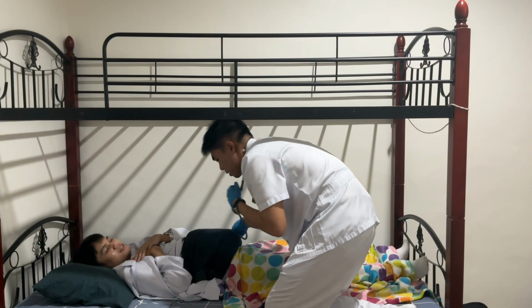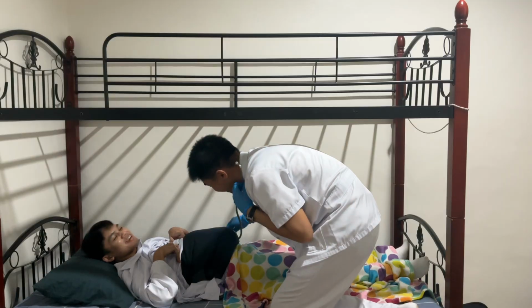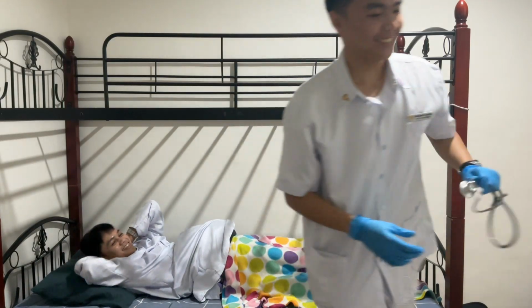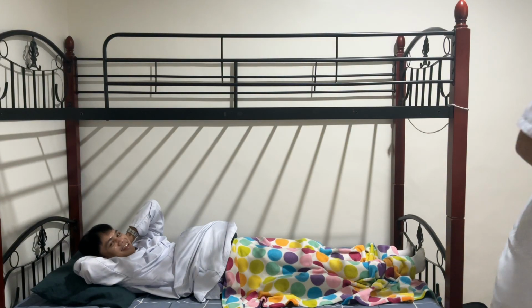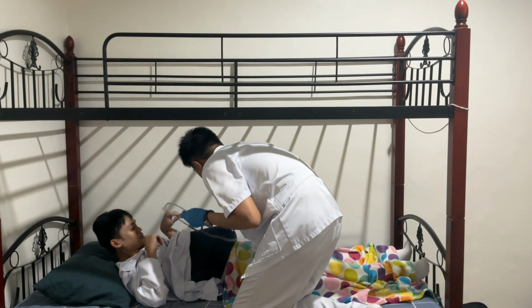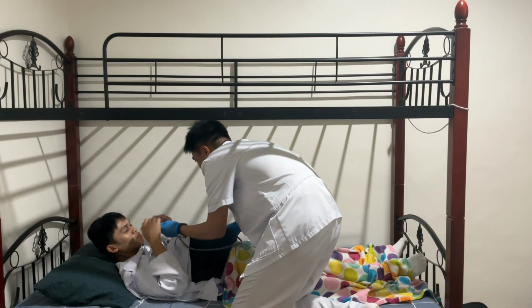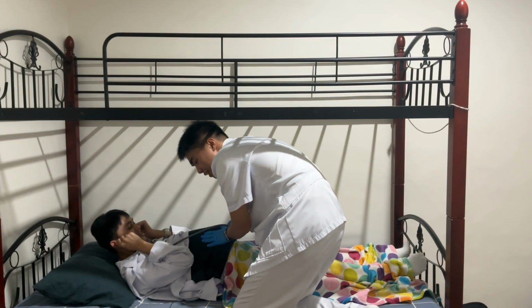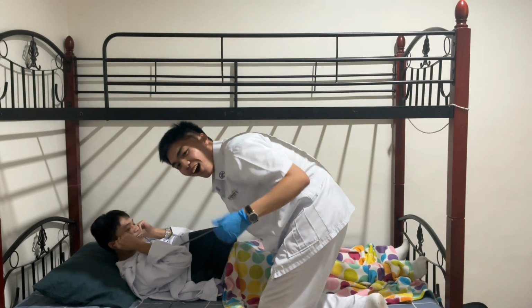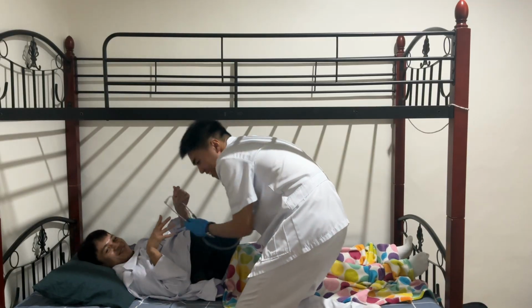So assuming it was 1 minute and I have listened to it, ma'am, do you want to listen to it? I will clean the stethoscope now so that you can listen to it. Here it is, ma'am. Where was it earlier, ma'am? I'm going to find it for you. Listen. Do you hear it? I can adjust it if you don't hear it yet. Yes. Oh my gosh. So that is the fetal heart tone of your baby. She's alive.